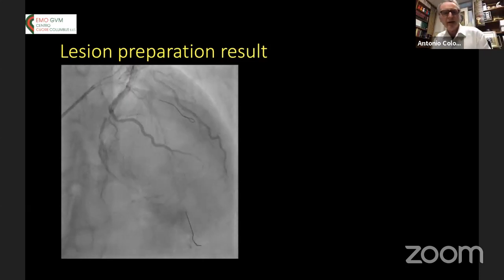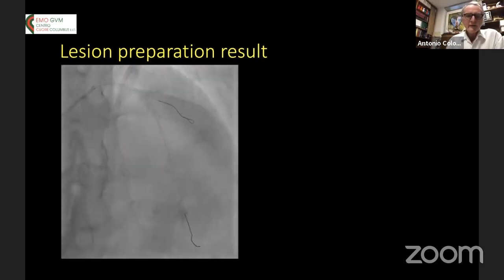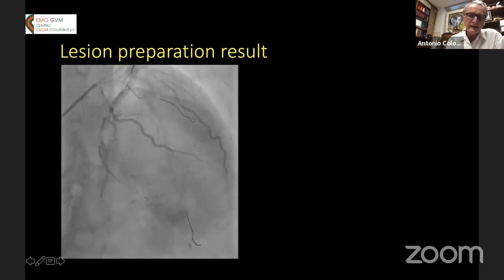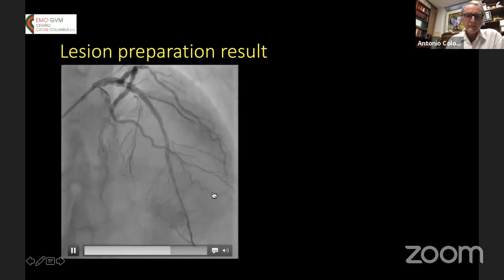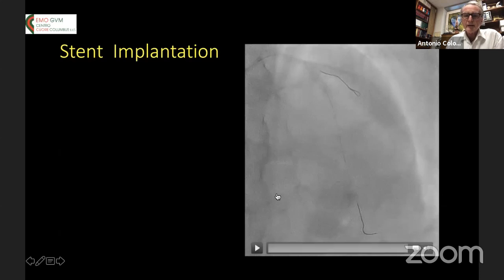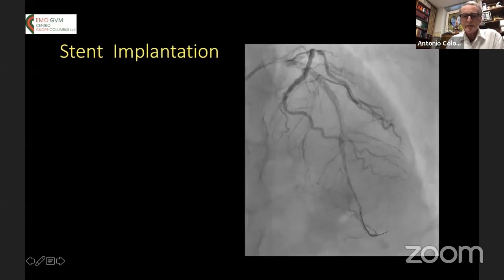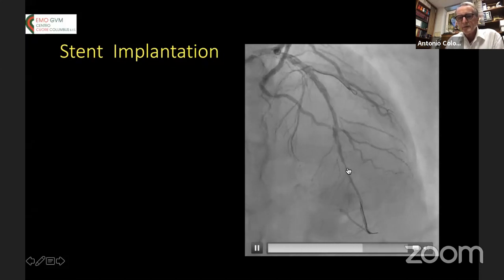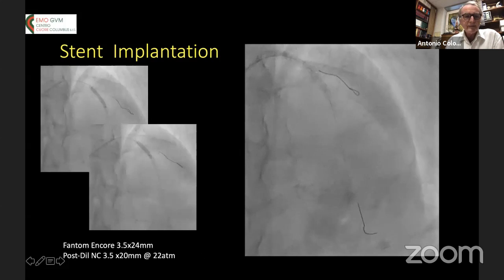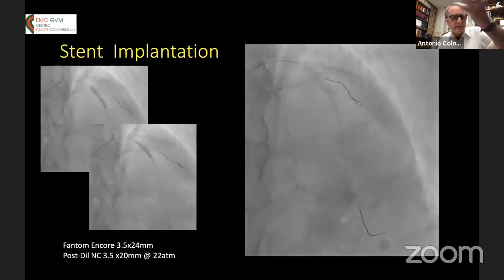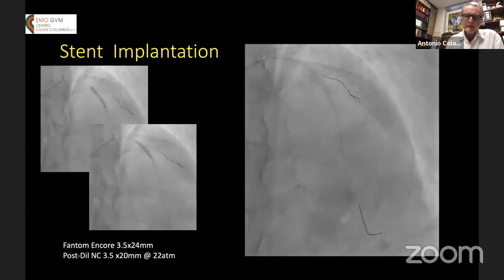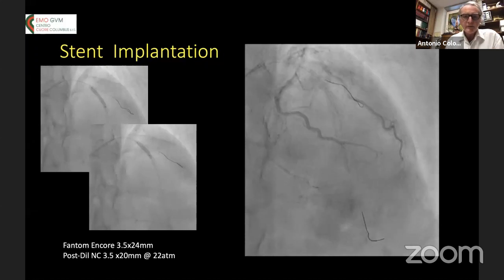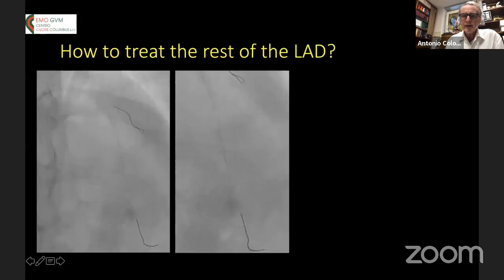After lesion preparation, the lesion is ready to be stented. You would place a stent proximally and another long stent more distally, and get a nice immediate result. There is still some residual stenosis in the distal part, and we placed a stent — in this case a bioresorbable scaffold proximally, but you can place a metal DES — with a good result. But then how do we treat the rest of the LAD?